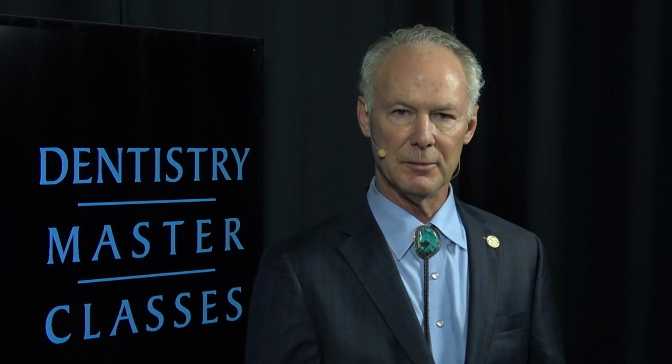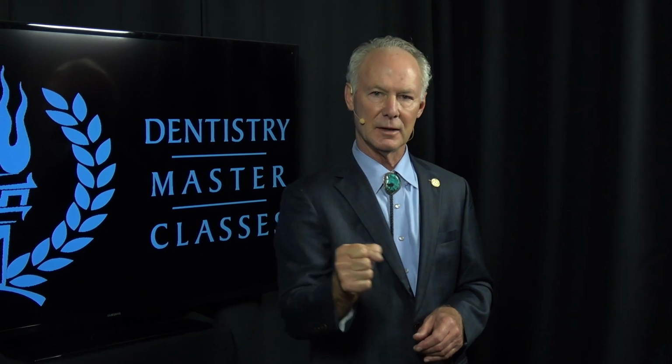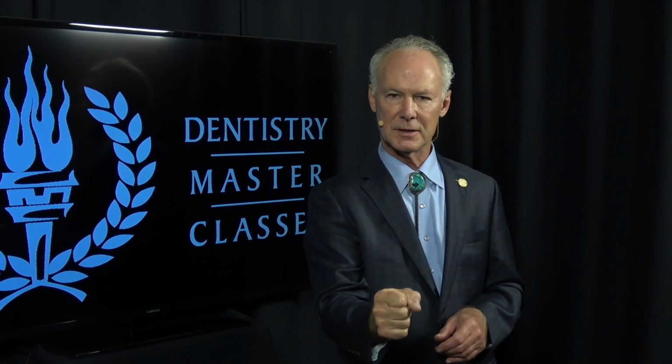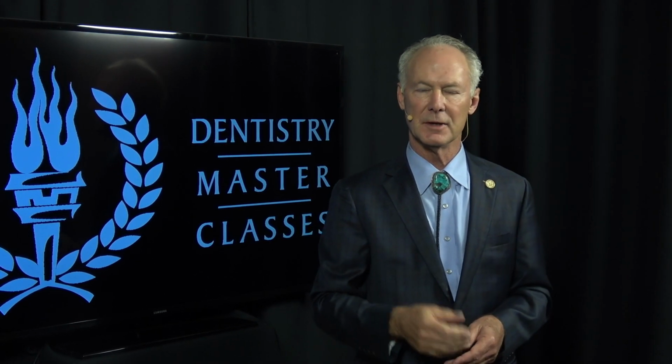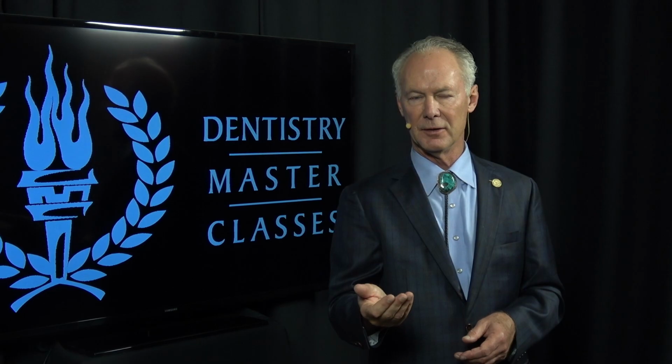To my knowledge, I've never lost a root form implant. Now, I've had patients come into my office that have lost implants. Most of those, the implant was loaded at the time of placement. Well, I grew up ranching, and I think of a fence post that you place in concrete. If you move that fence post before the concrete sets, you're going to lose the fence post, and that's what happens to implants many times that are loaded at the time they're placed.